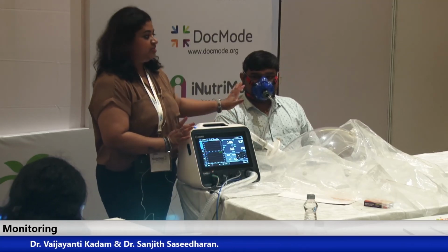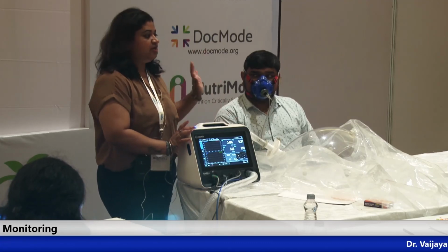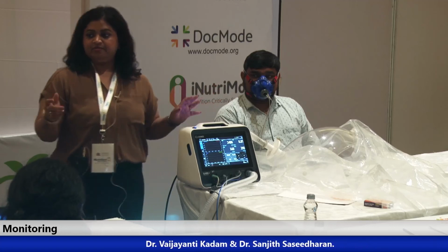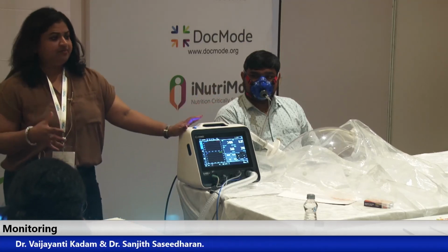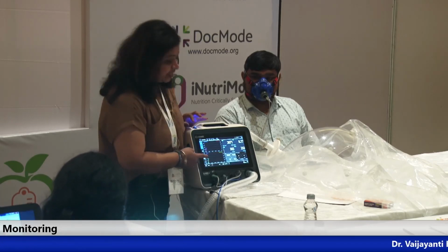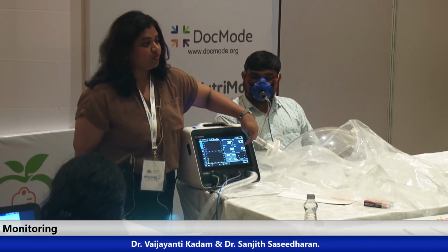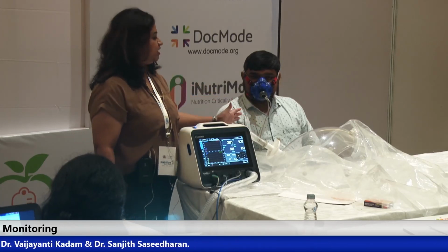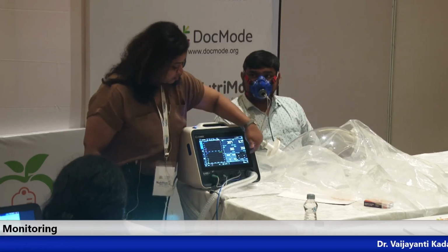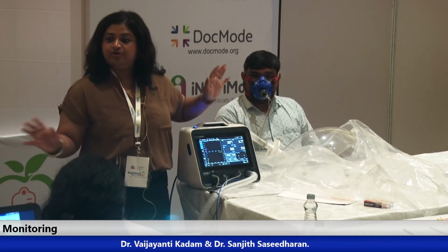Now this man is just sitting over there in a steady state where he's breathing very easily. In his case, we are going to get resting energy expenditure very quickly. Steady state is going to be achieved very quickly, and just now what you are seeing is the machine has started testing it. And the variation is just zero. That's zero because there is no change at all, because he's breathing very steadily. The moment he starts breathing faster, this will start changing and you will get a variation. So that measurement we are not going to pick up.